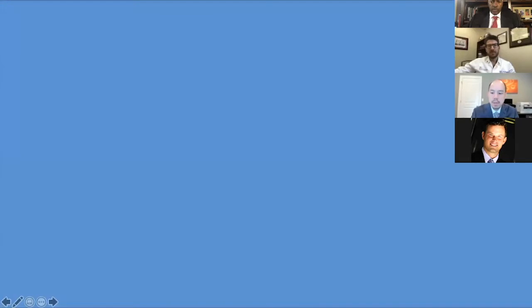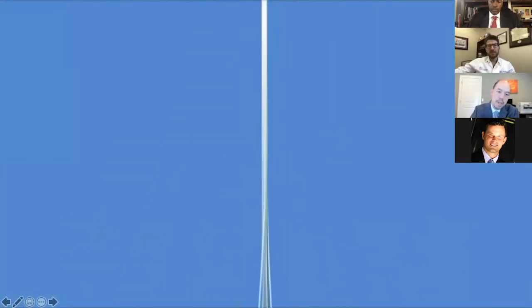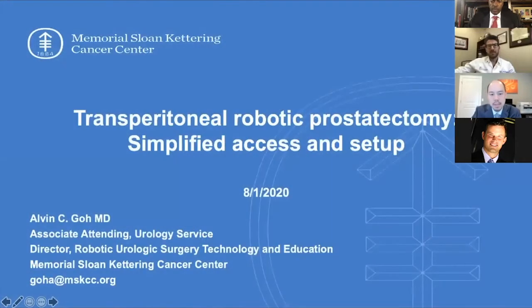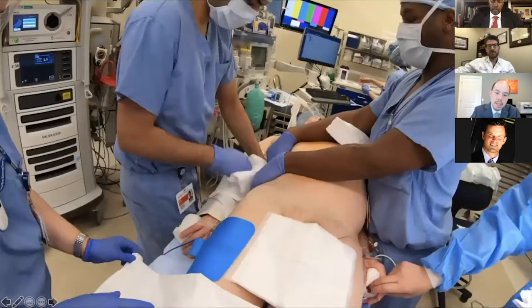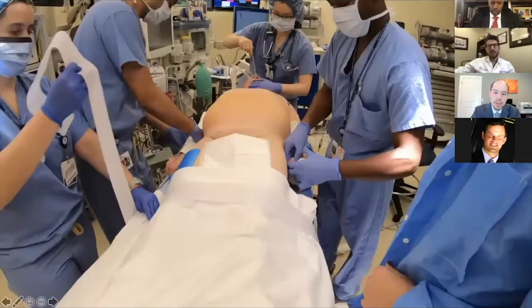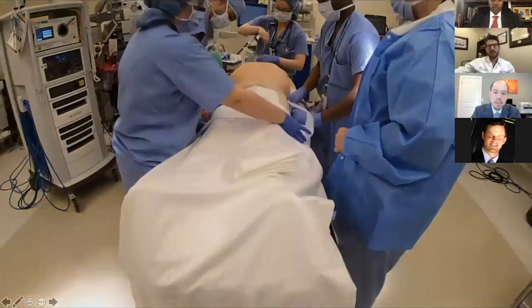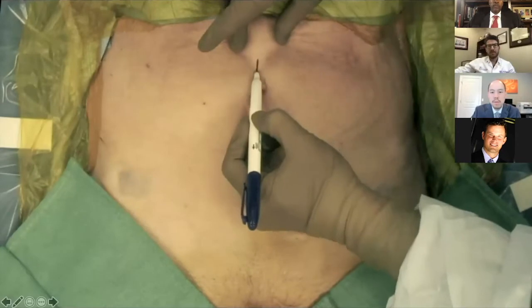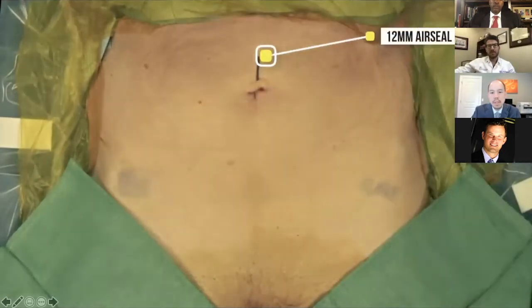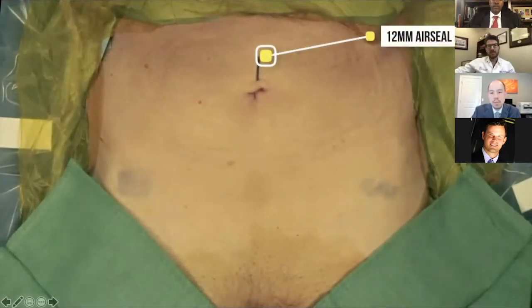I'm going to start with a video that will display a very simplified technique for access. I think this makes it very reliable and easy to get access and then place the ports. We'll start with that supine positioning, and we'll make a 12 millimeter incision just above the umbilicus — this is where our air seal port will be placed.